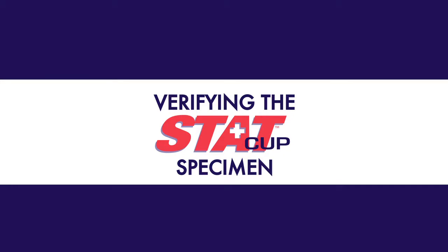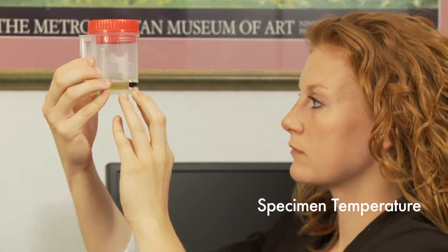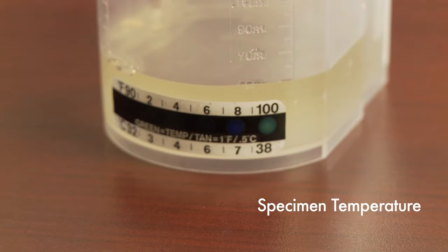Verifying the StatCup specimen. Specimen temperature indicates a valid donor specimen. Check the temperature strip on the StatCup within 4 minutes of receiving the specimen. The temperature should register between 90 and 100 degrees. The strip will turn green to indicate the specimen temperature. If the specimen does not register as valid, stop the testing process immediately. Do not interpret the results and proceed with your company's policy for invalid specimens.